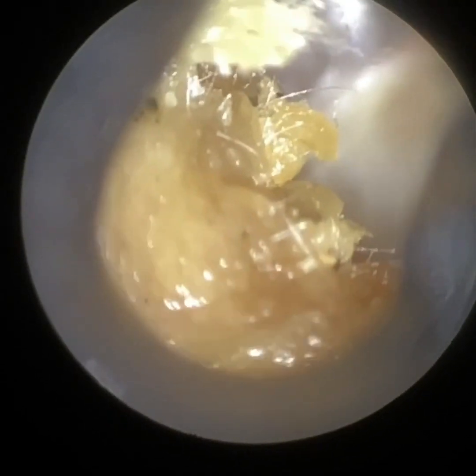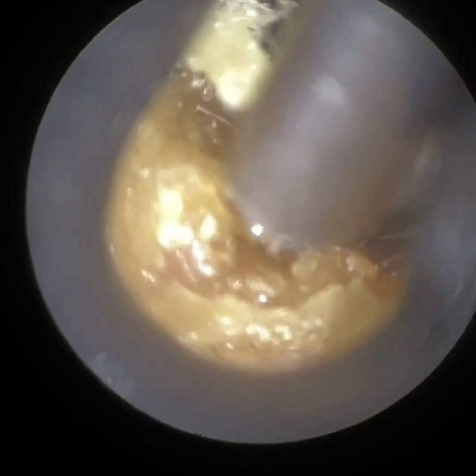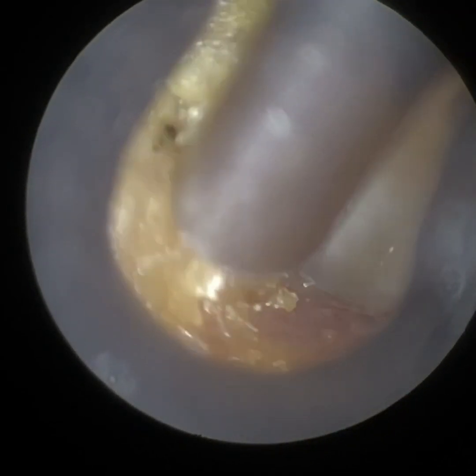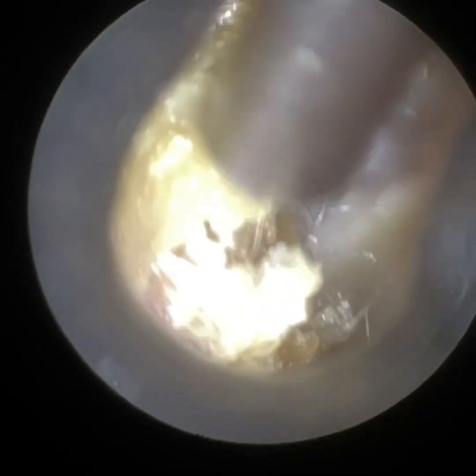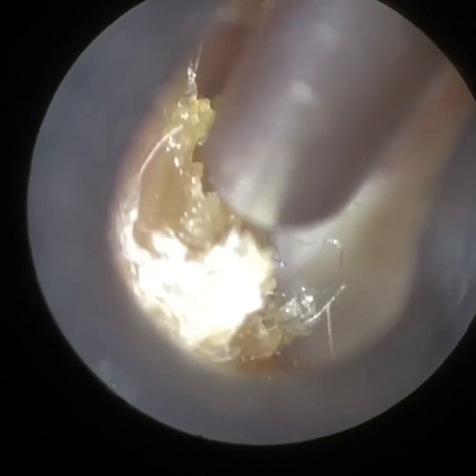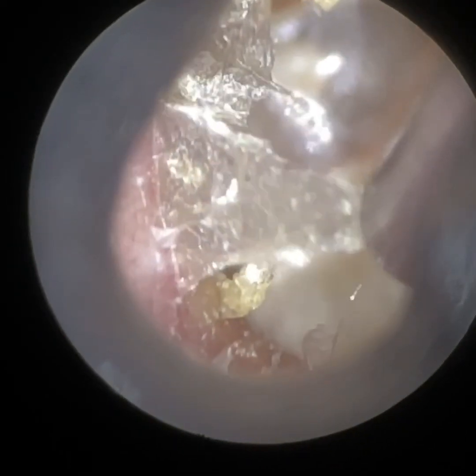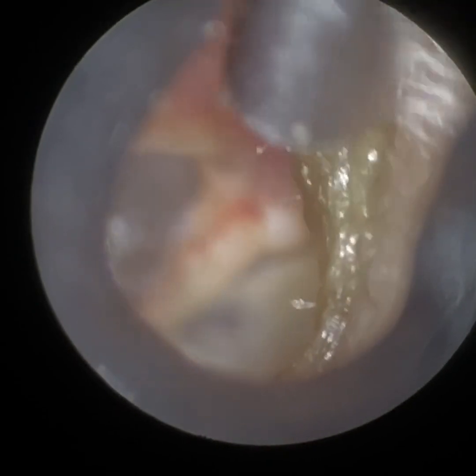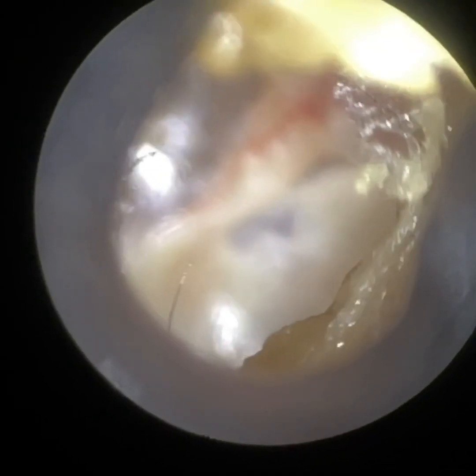What's interesting about this particular case is that — and you will see once I've removed all this wax and dead skin — is that this patient's incus has eroded, which has then caused the head of his stapes to become visible. So the patient has got quite a severe posterior tympanic retraction, and the eardrum's wrapped itself over the head of the stapes bone, which is visible because the incus has eroded. The patient has had multiple ear infections growing up. Because the eardrum is actually wrapped around the head of the stapes, he's only got a very mild conductive hearing loss. He's still getting the transmission of sound, not via the ossicular chain — he's just getting it via the stapes, really.